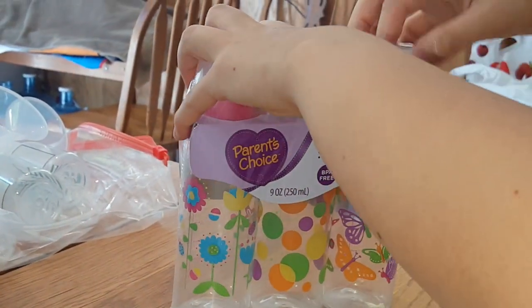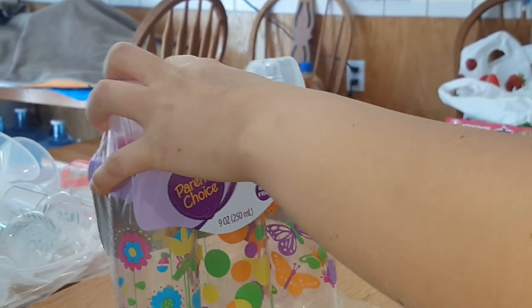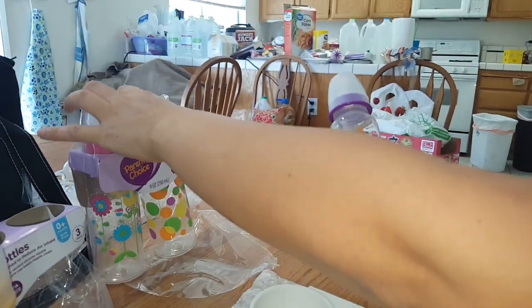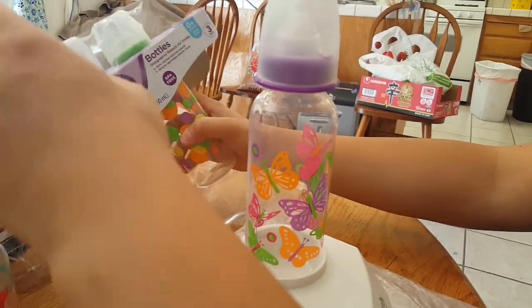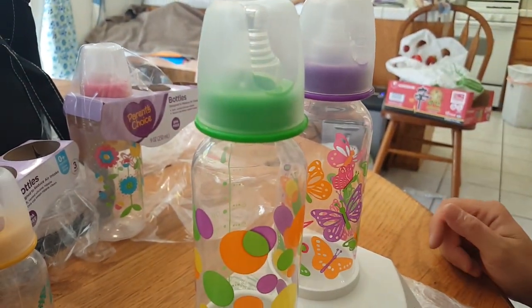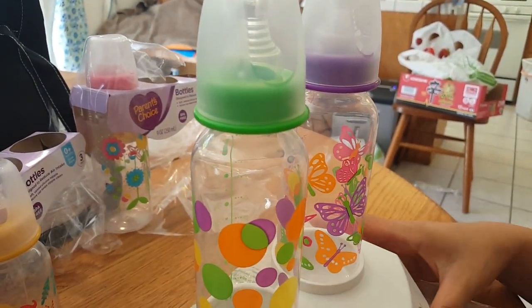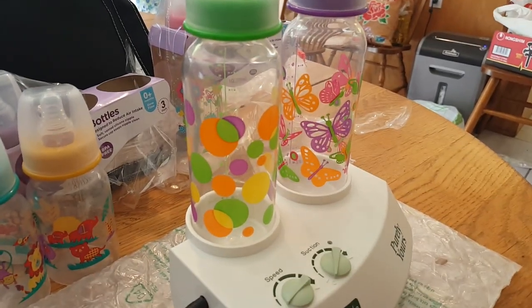Baby can drink out of them right after we're done. When baby gets bigger or if I have more milk that I'm pumping and the 5 ounce bottles aren't enough, then I have the 9 ounce ones, which I've used before too. So it's very handy and I like how it fits.